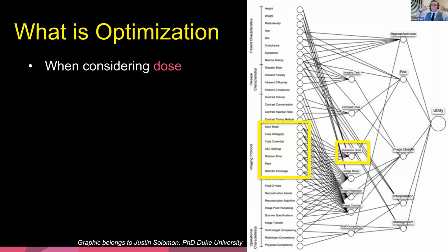And the reason behind that is, I mentioned that when your system is trying to ramp up radiation, you obviously need a lot of radiation to get through your shoulders compared to your neck and even the jaw up to C1, C2. And so when you start imaging right here, you don't need a lot of radiation. So you'll start with a moderate amount, but then as you start scanning down, once you get into the neck, if you look at the dose profile, it's going to go up and then it's actually going to go down. There's not a lot of tissue here.